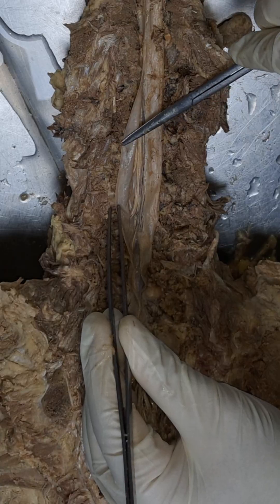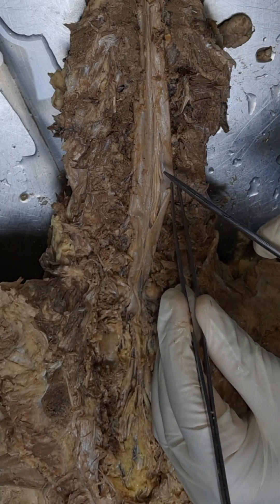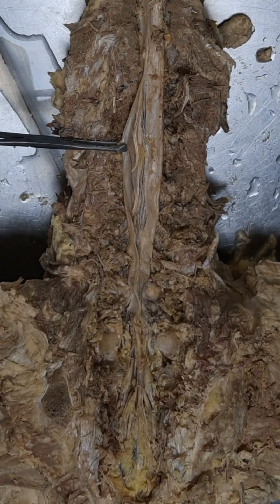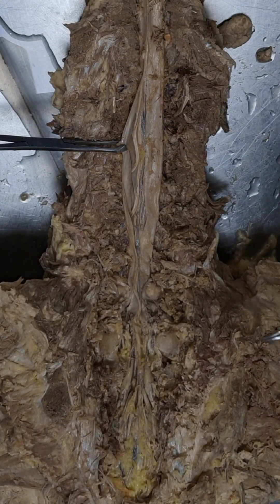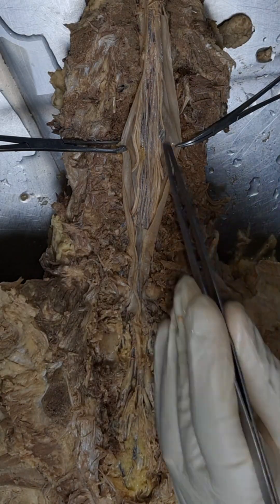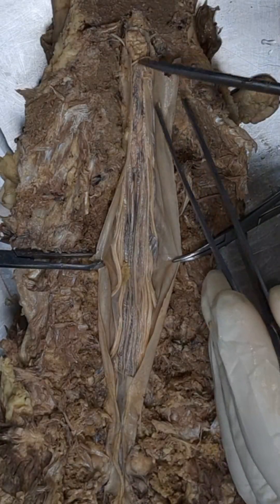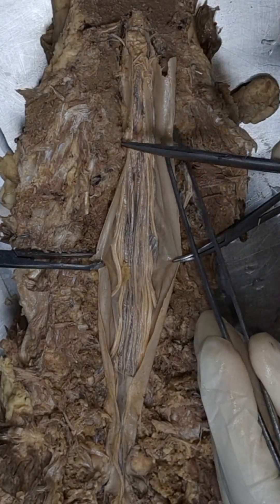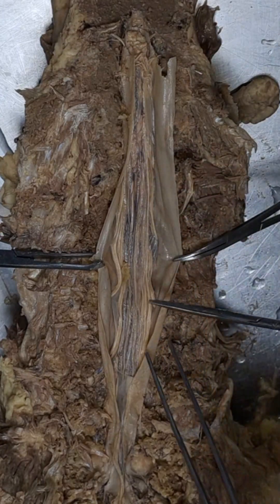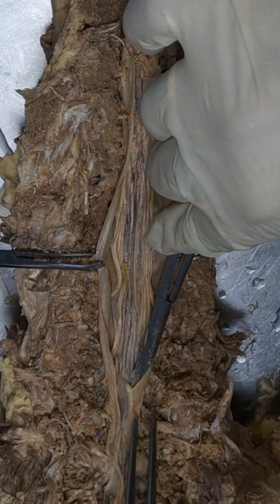We can see inside how the cauda equina looks. It is now very clear. You can see the conus medullaris and the cauda equina, and how the rootlets are coming.